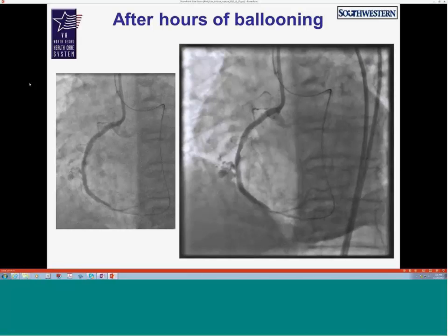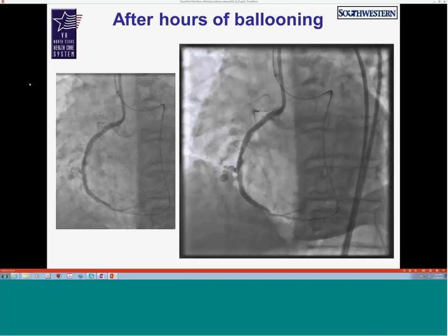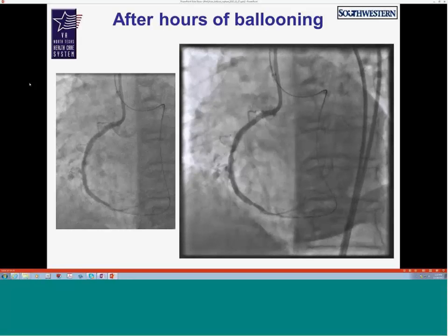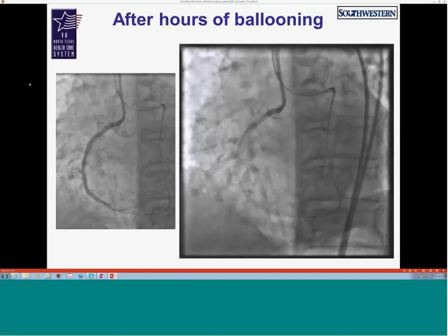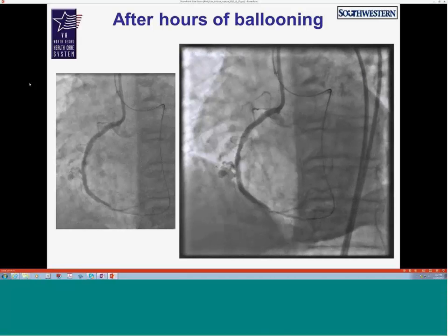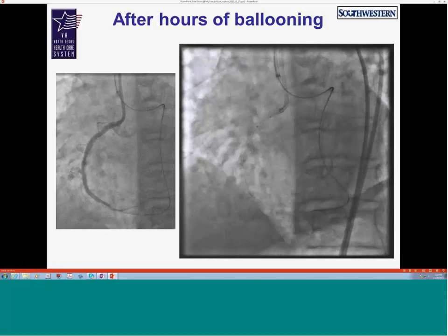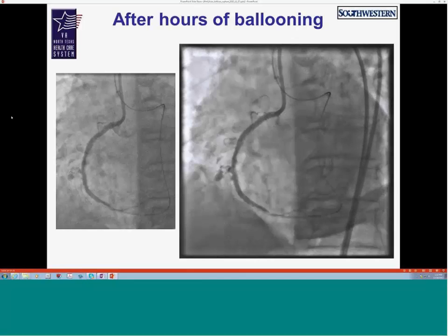So the other thing here, at this point, the blood pressure was getting a little lower, probably in the 110s. It was 160, 170; it started with 110 or so. Pressure was getting a little on the lower side, and on the echo there was a little more effusion. Initially I was hesitating to drain the effusion, because the theory is that a little bit of blood in the pericardium helps tamponade the perforation, whereas if you drain it, it may bleed more through that perforation site. I don't know if anyone has that theory. Obviously, if the patient is hypotensive, that's not an issue. But if you're borderline, you try to hold off tapping, at least from the beginning.